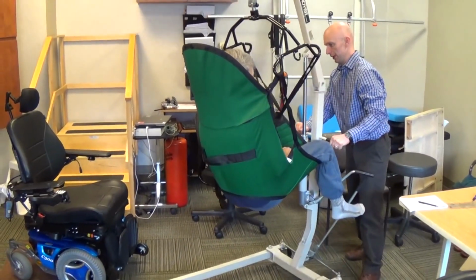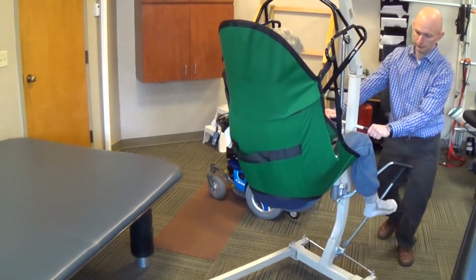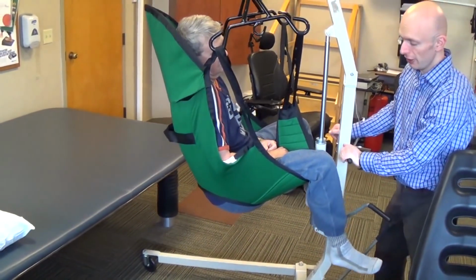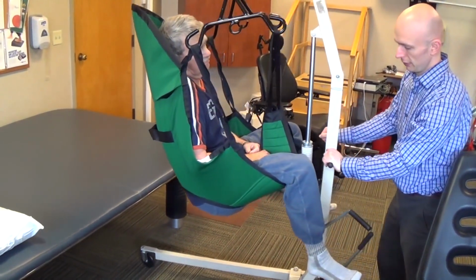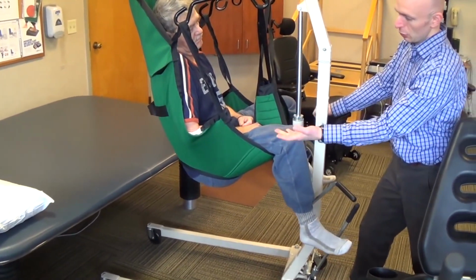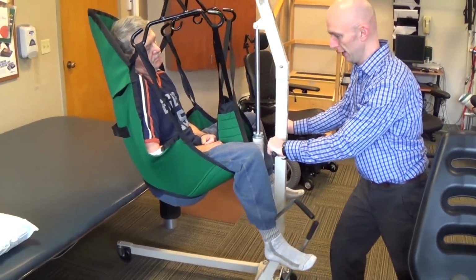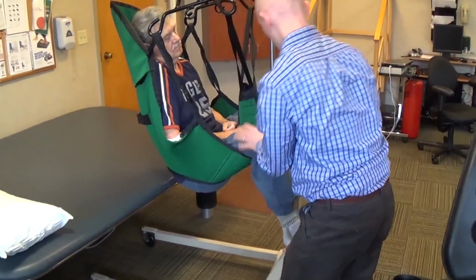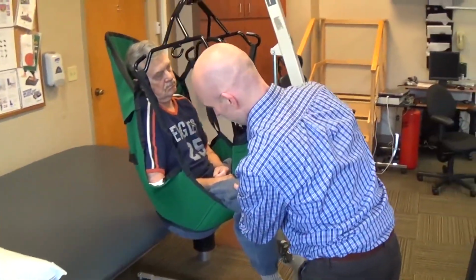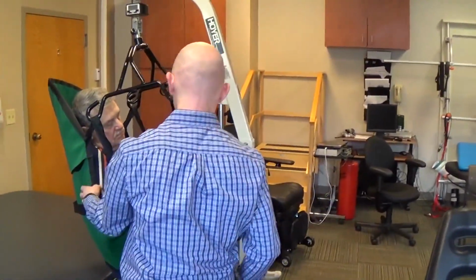We're going to go to our bed. Making sure the area under the bed is free of any materials, or any cords or lines or tubes are tucked away and placed to the opposite side. You might be required to lift the client up a little bit more so their bottom clears the edge.